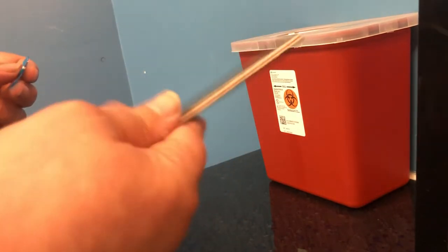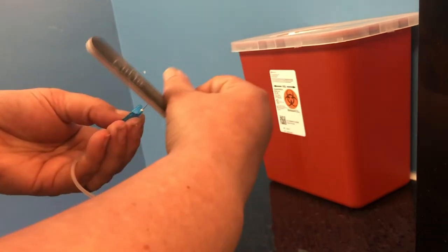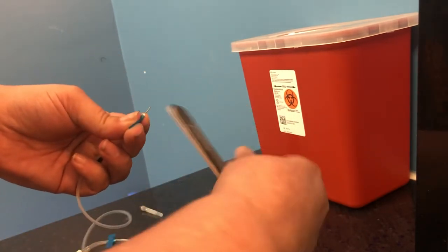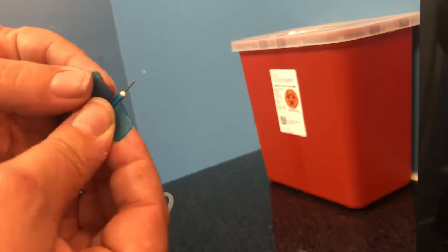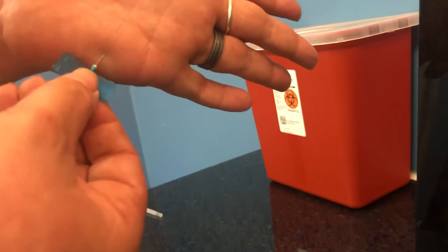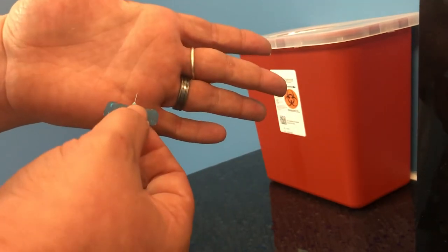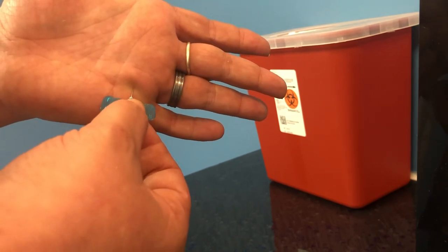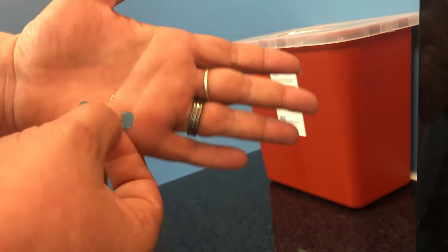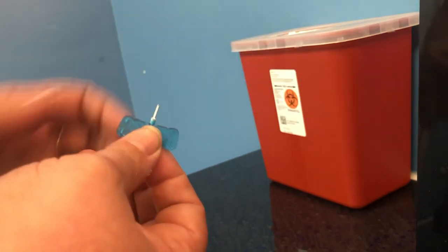To solve that, I just use a regular emery file and give it a little bit of love here. And then what I have is a nice blunt tip that also doesn't have a burr in it anymore. And I always test these on my hand or on a little bit of skin so that I know that they are harmless and I can push relatively hard and it's not gonna make any rent or hole in the skin. And so I can feel confident that that's gonna be a safe training tool to send home with an owner and a team.